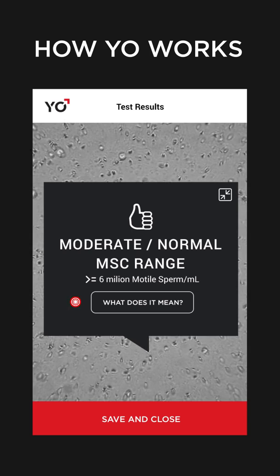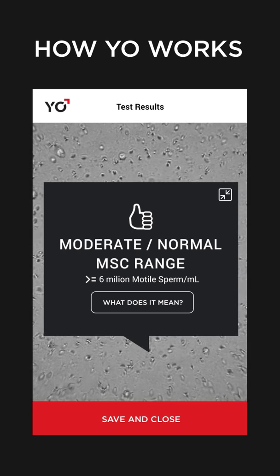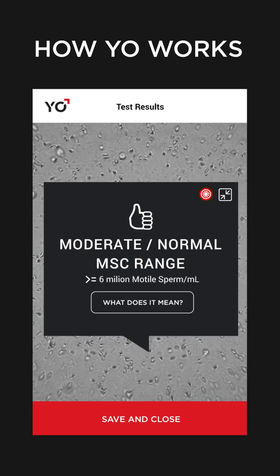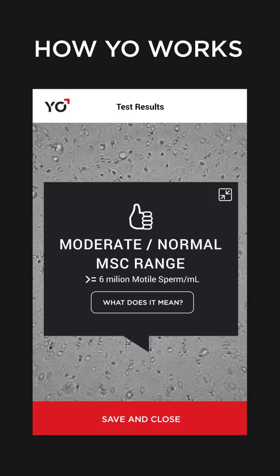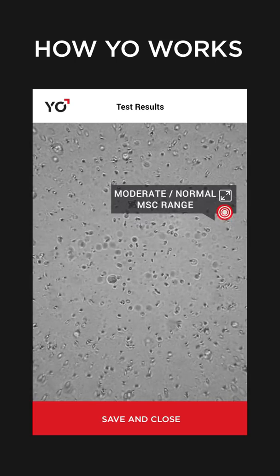To find out more about your test results, tap What Does It Mean? View your swimmers in action. To see your sperm in full screen, tap the Minimize button. To enlarge your sperm, stretch your screen.